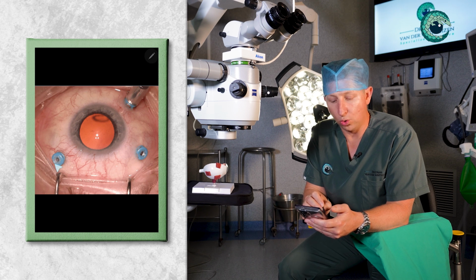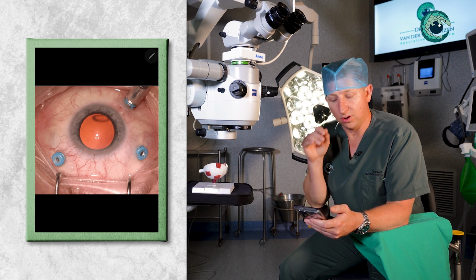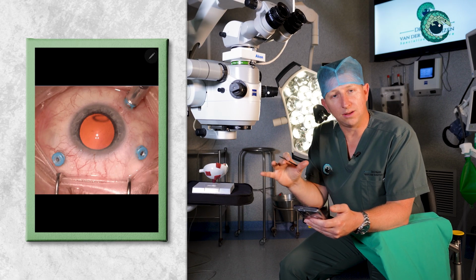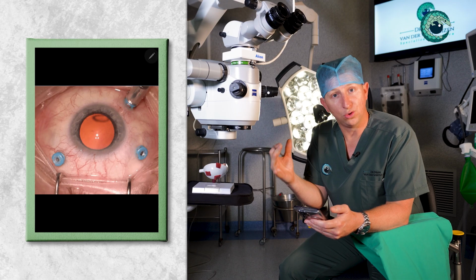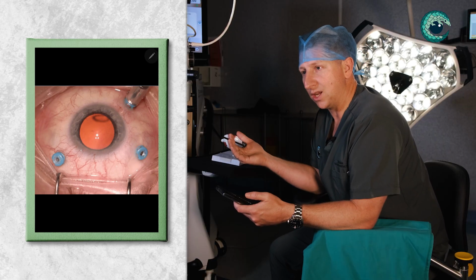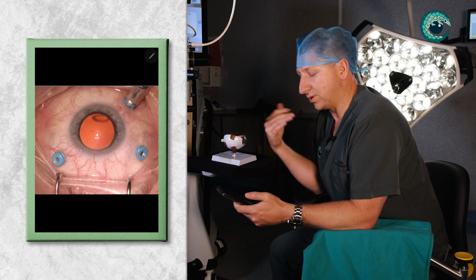The one port normally is a light source. It's a small fiber optic cable with a light source on the end that goes into the eye to illuminate the inside of the eye, and that gives us a good view so we can see what's going on. And then the last port is where we put instrumentation, whether it's a vitrectomy cutter or scissors, etc.